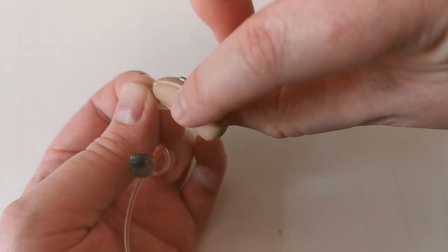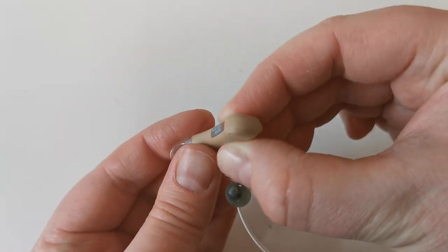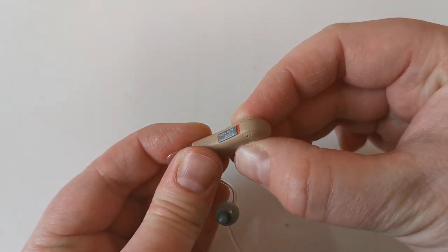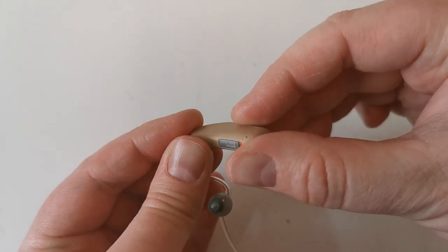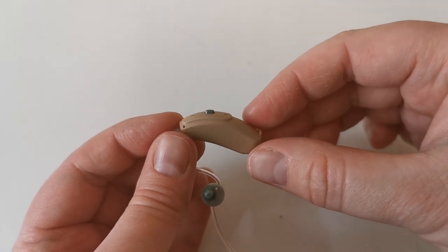There are left and right markers at the bottom of the hearing aid. The right-sided hearing aid has a red marker, whereas the left-sided hearing aid has a blue marker in the same location.